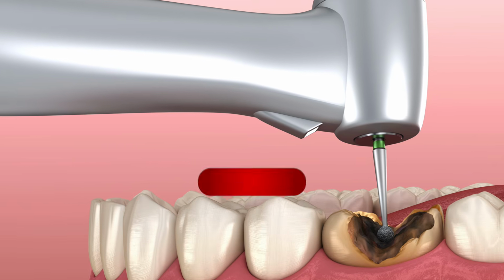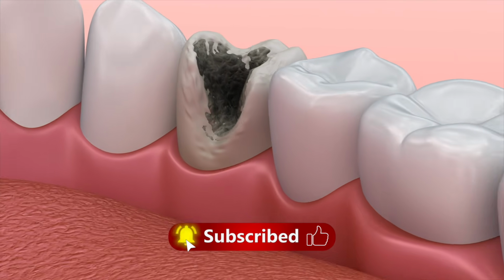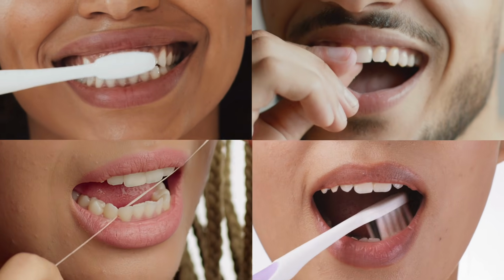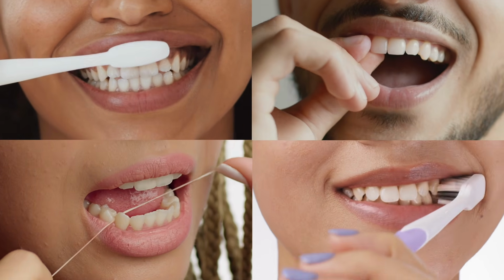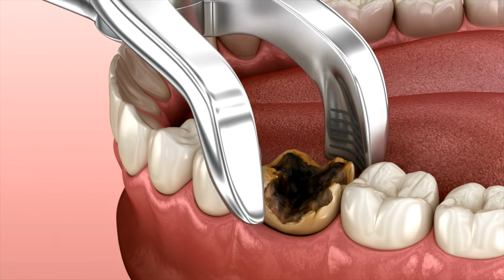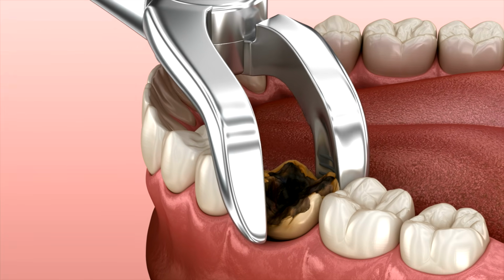The treatment for a cavity involves the precise removal of the decayed tissue using a dental drill. This creates a clean, bacteria-free environment for the restoration. Once the cavity is prepped, a bonding agent is applied to ensure the filling adheres perfectly to the remaining tooth structure. Then, a composite resin, a tooth-colored material, is layered into the cavity and cured with a specialized high-intensity light.